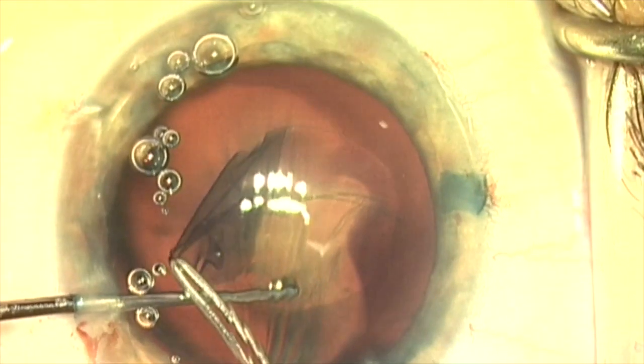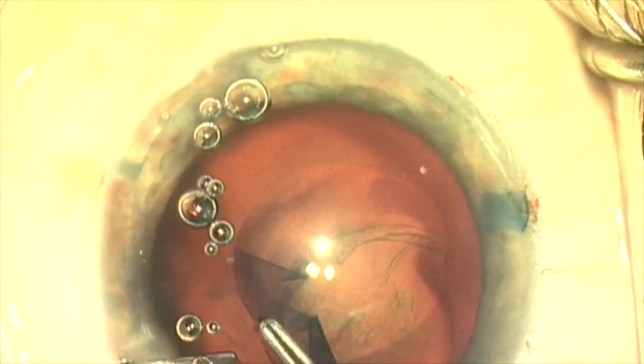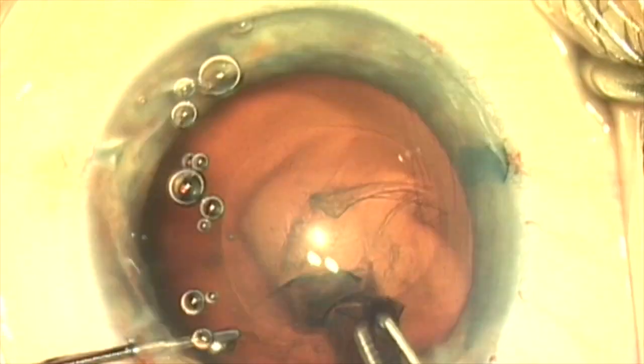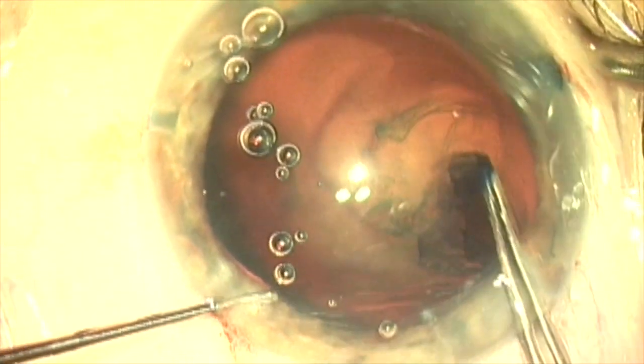When I tear against the side that has some zonules remaining, I don't need to stabilize as much. Here you can see I'm completing the capsulorrhexis, and I'm centering it on the lens — not on the pupil — because the lens is dislocated.